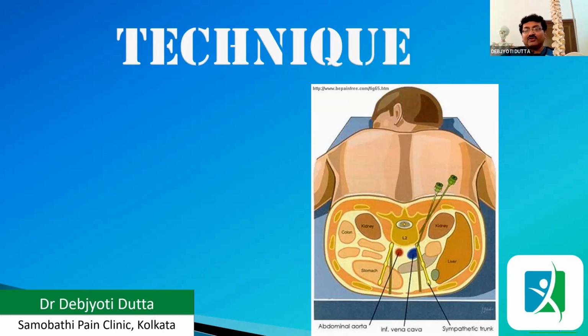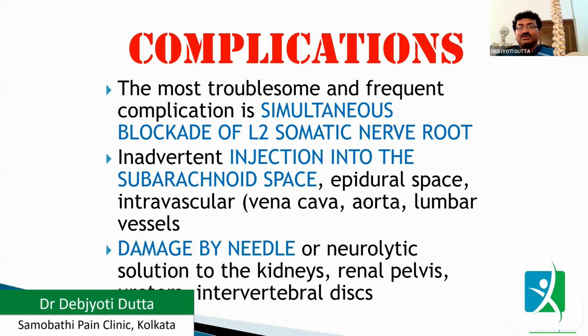If you are doing a radiofrequency ablation, then at this point, go for the stimulation, both sensory and motor. Here, as it is mainly a sympathetic block, you may not find any movement. Actually, if you are getting any movement in the legs, that is dangerous. So we are not expecting anything. Once we are done and we are seeing that the leg muscles are not moving, then we can give local anesthetic first. Then we have to do the lesioning at 80 degrees Celsius for 90 seconds. And in radiofrequency, we do it at all 3 levels. So that was the technique.